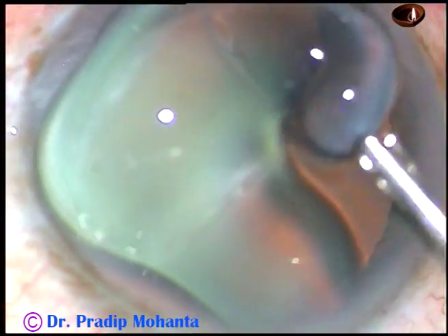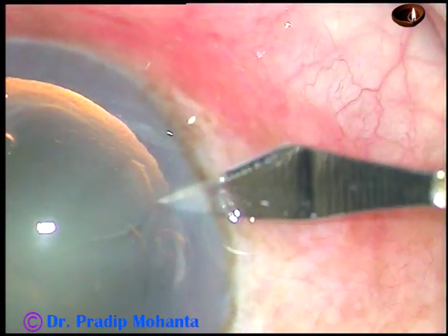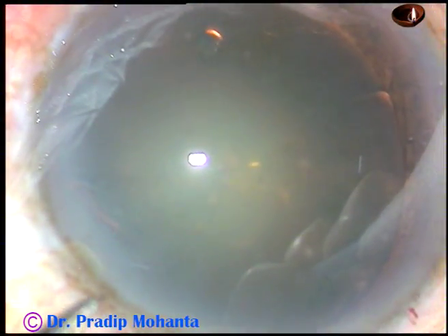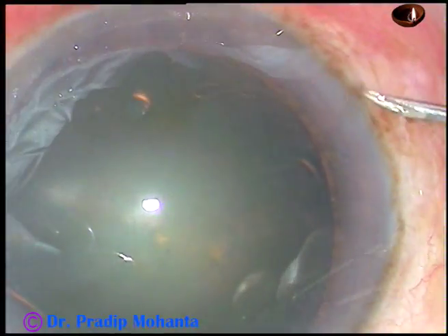Viscoelastic substance has been injected into the anterior chamber and it is sprayed over the corneal epithelium — it improves visibility. This is a side port on the right side of the main incision, and this is another side port on the left side of the main incision. So we have one main incision and two side ports.